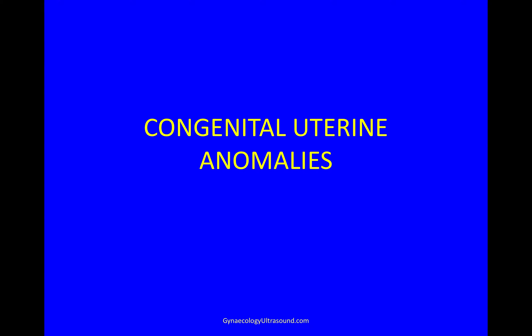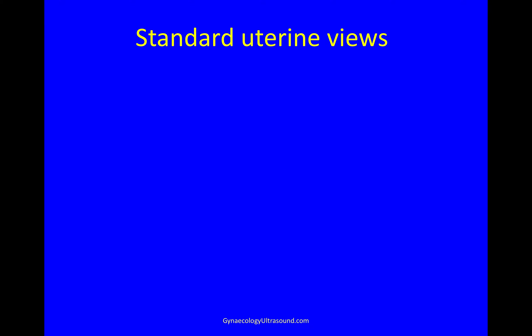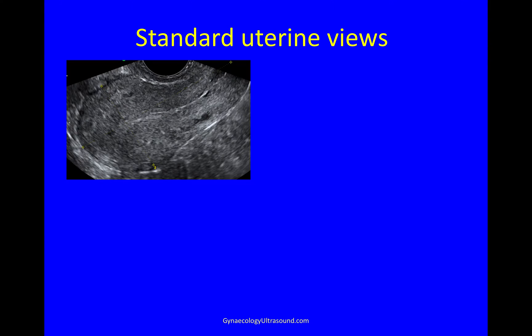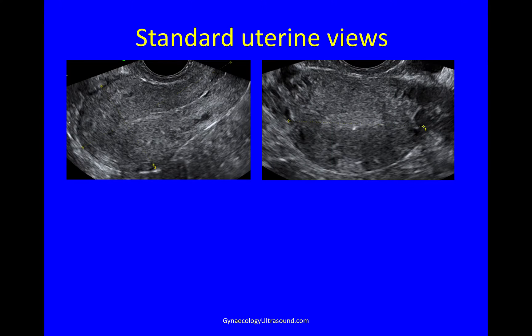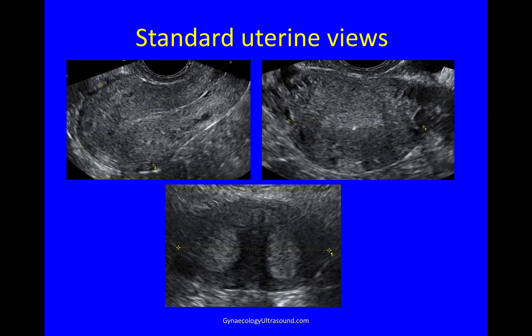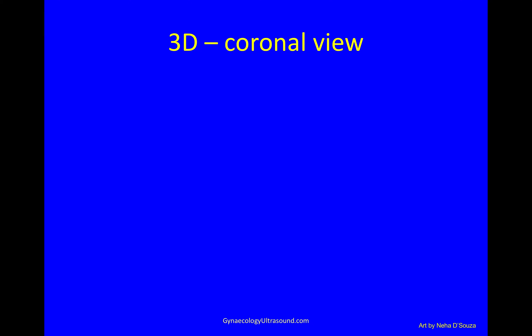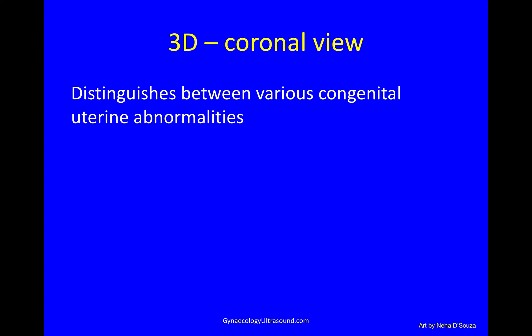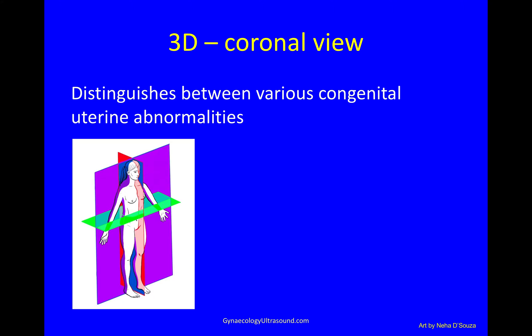3D is very useful in the diagnosis of a uterine anomaly. In standard 2D uterine views you get the longitudinal plane and the transverse plane, but when in the transverse plane you see a separation of the endometrial cavity near the fundus, you don't know whether this is an arcuate uterus, a subseptate uterus, or a septate uterus. You need the coronal plane to distinguish between these different abnormalities.